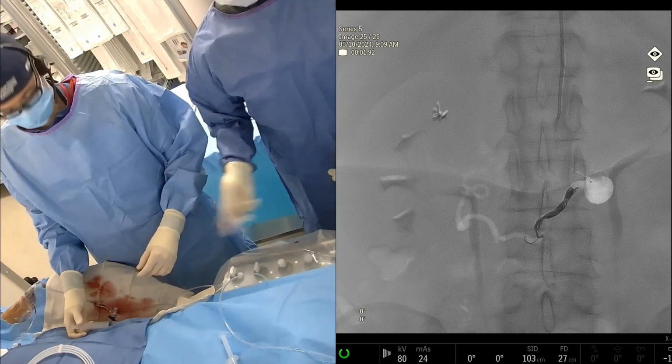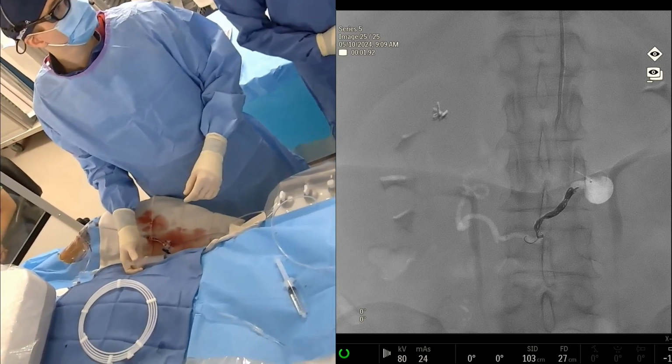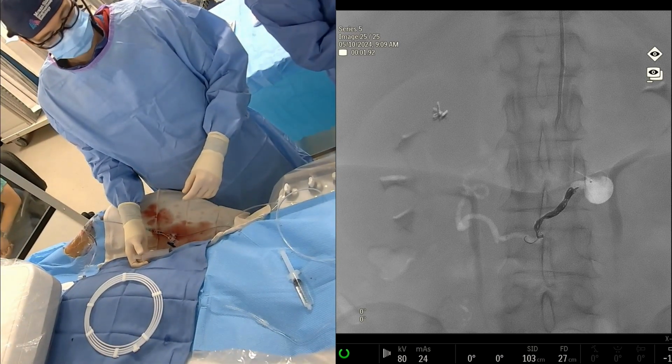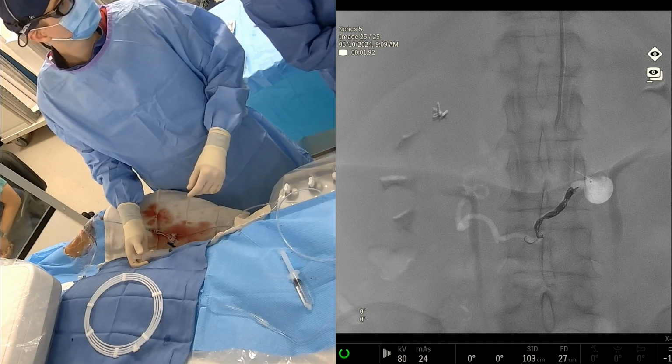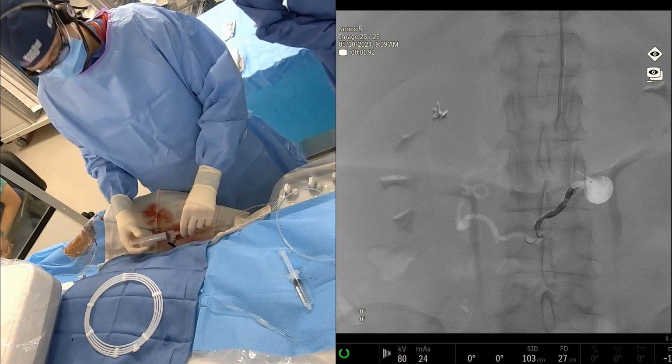And then we're putting this through a high flow direction. We could obviously put this through a True Select as well, so you don't really have to think about the microcatheter that we're going to use. Should we do another of the same? Yeah. Rahul, did you mention the microcatheter that you're using here? I don't know if I missed it. It's a high flow direction. Okay.